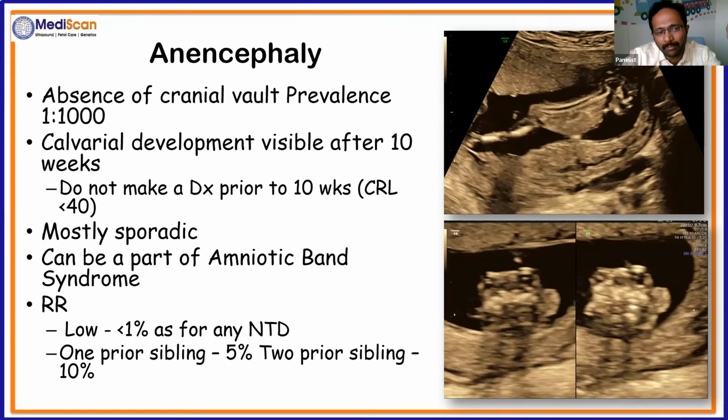The most common structural malformation that you would look at is anencephaly, and it happens because of an absence of the cranial vault of the baby. The calvarial development is visible after the 10th week, and hence we should be careful never to make this diagnosis prior to a CRL of 40 mm or before 10 weeks. And at that point of time, if you have a concern, there is nothing wrong in calling the patient back a week or 10 days later. Mostly it's sporadic in inheritance. Sometimes it can be a part of an amniotic band rupture sequence. And if it is an isolated problem, the recurrence is less than 1%.